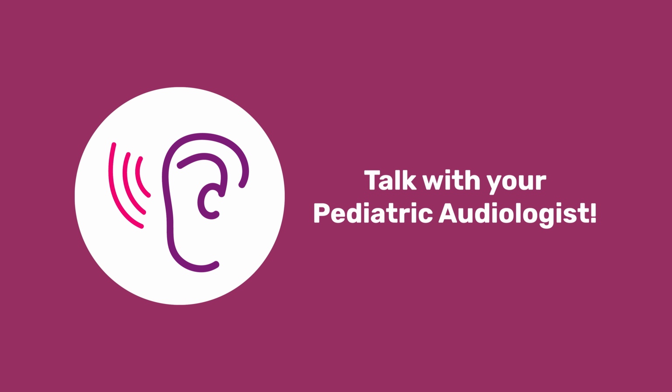They can answer your questions, will make sure your child's remote microphone is working well, and they'll make sure you know how to use it and care for it. Your intervention provider will coach you about how and when to use the remote mic system, and make sure you bring the remote mic to all your appointments.